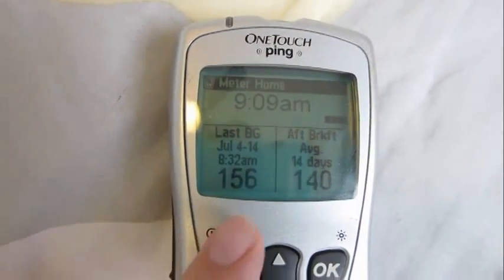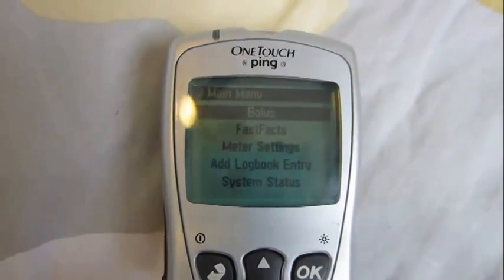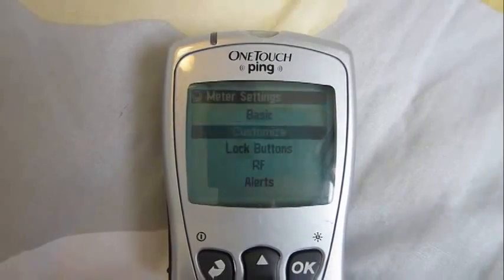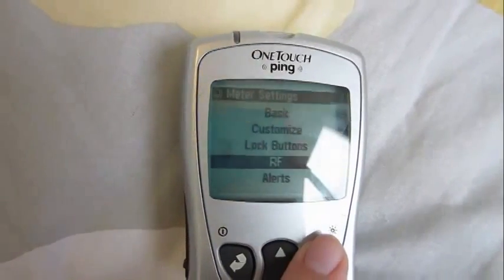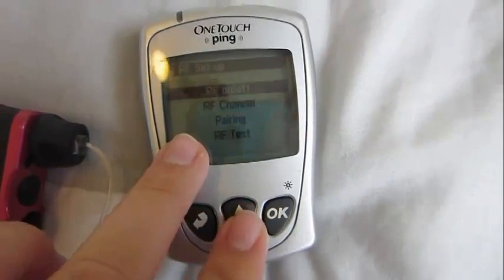So the first thing you need is your meter, and you just want to go ahead and turn it on by pressing the power button. I pressed power and turned it on, then press okay and go down to meter settings. RF is what you need in order to sync it. Then you go down to pairing.